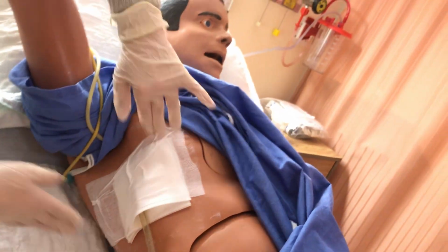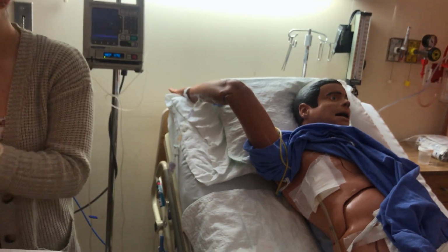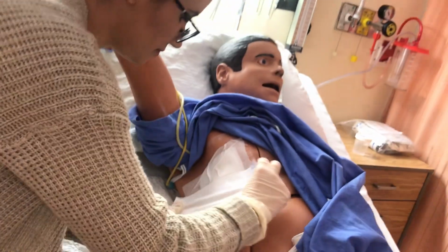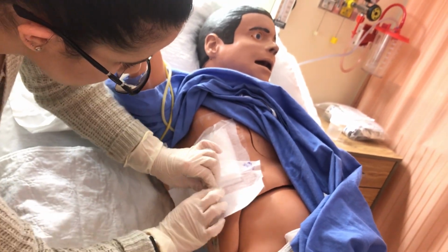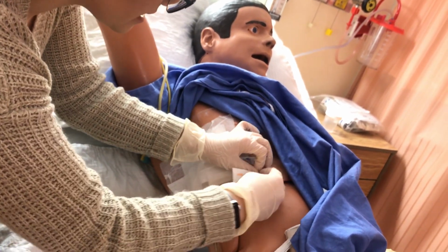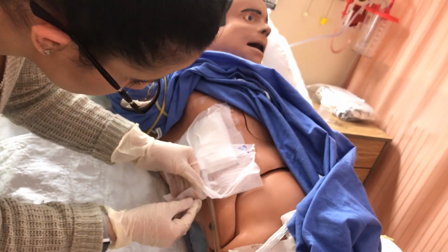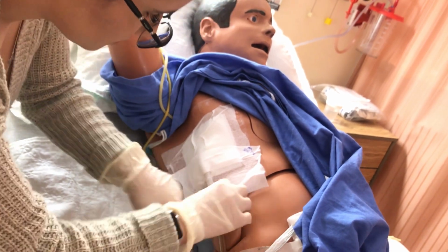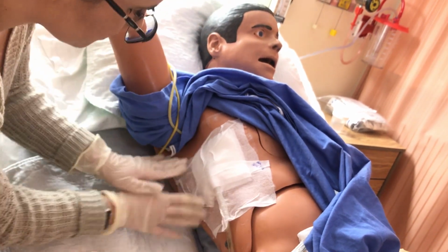Because it's so loud, I'm just going to turn it down for the dressing. And another one with my date and initials. I have an extra trach tube, I have dilators, I have extra trach ties, I have an extra disposable. So again, this is going to be fully occlusive. As well, I'm going to tent the chest tube, just in case the patient accidentally pulls on it. It will pull on the dressing and not the actual tube. So that's tented, and I see that it's fully occlusive.